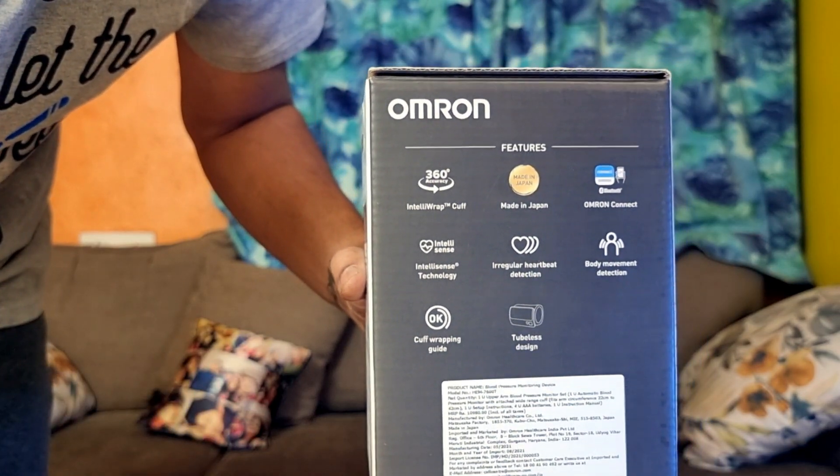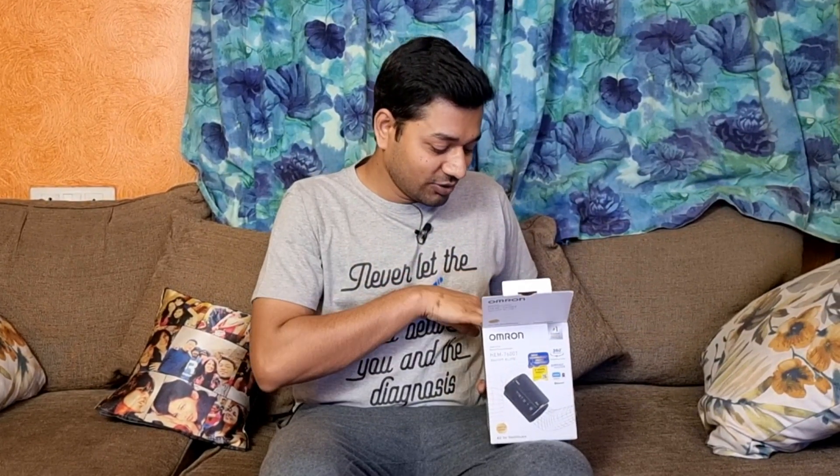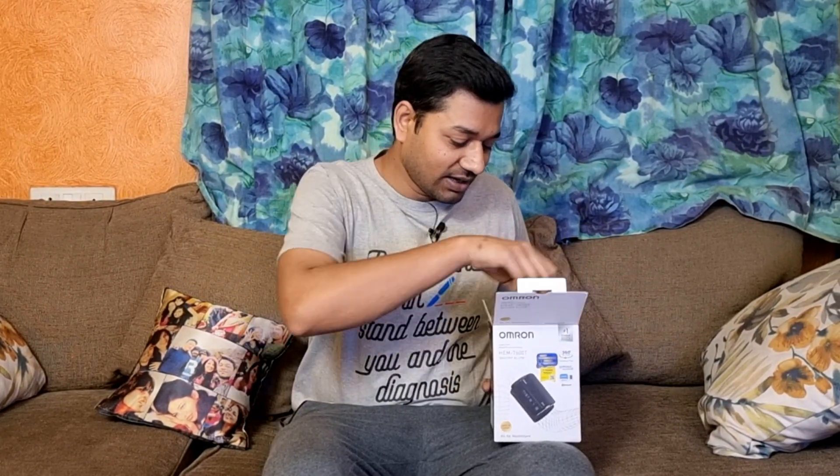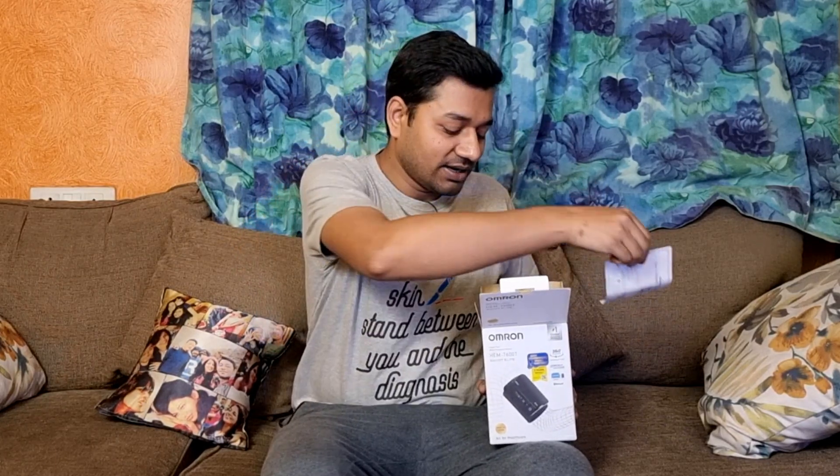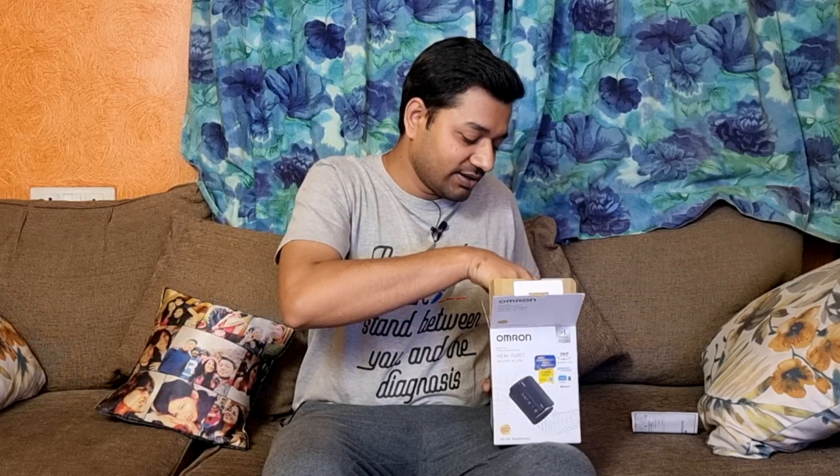Let's see how the package is. We have to open the door and the door has a warranty card. The machine is in the bundle.